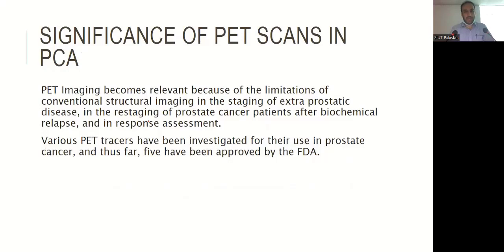Significance of PET scan in prostate cancer. PET imaging becomes relevant because of the limitations of conventional structural imaging in the staging of extraprostatic disease, the restaging of prostate cancer patients after biochemical relapse, and in response assessment. Various PET tracers have been investigated for their use in prostate cancer, and thus far 5 have been approved by the FDA.